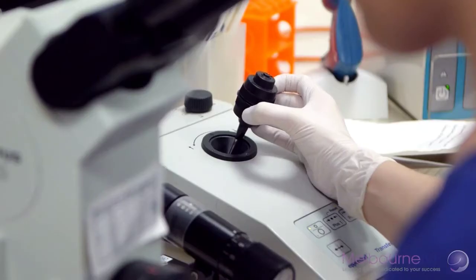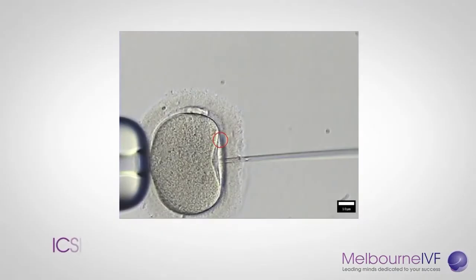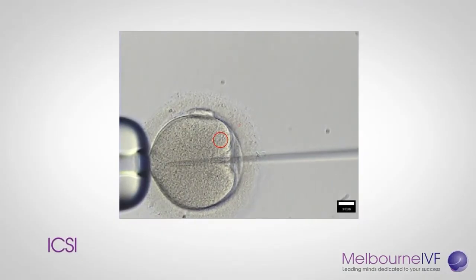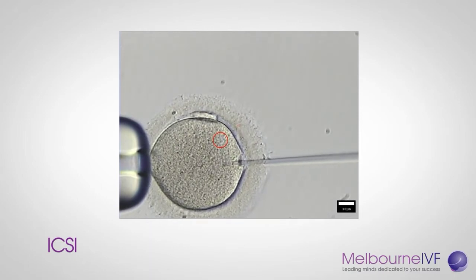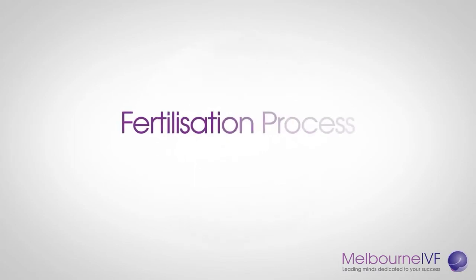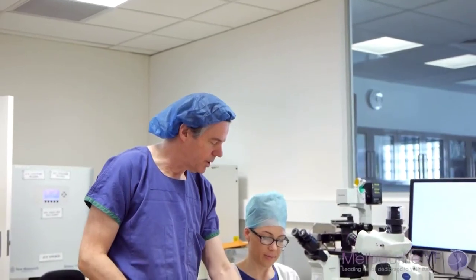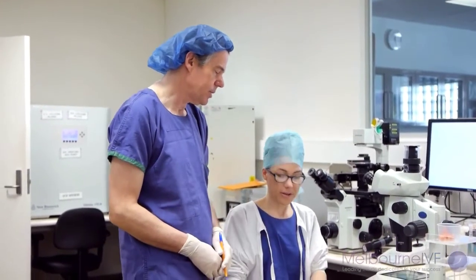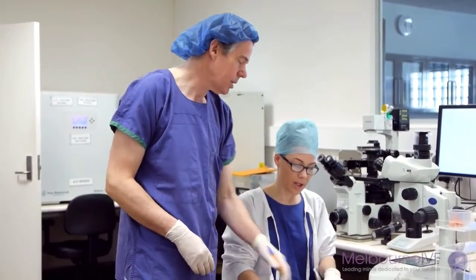As the egg is 1/10 of a millimetre in diameter and the sperm many times smaller, an embryologist performs this delicate procedure under the microscope. The fertilization process. At Melbourne IVF, we offer a model for embryo culturing that is designed to provide each individual patient with the best possible outcome.